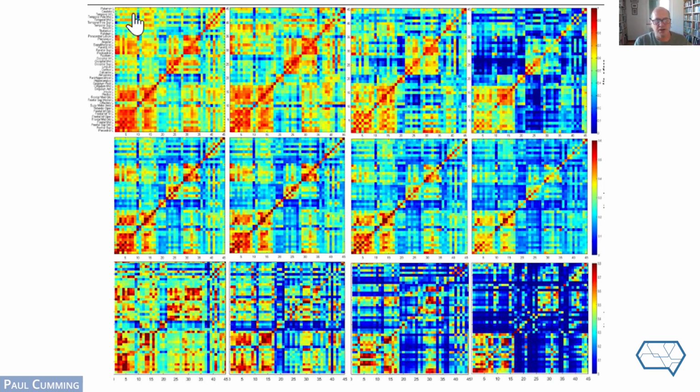And so within a series of healthy subjects, you could get a whole range of results, but the overall pattern is the same, that some regions of the healthy brain are sort of talking to each other and are entrained metabolically with each other in the normal operation of the brain. Next slide.